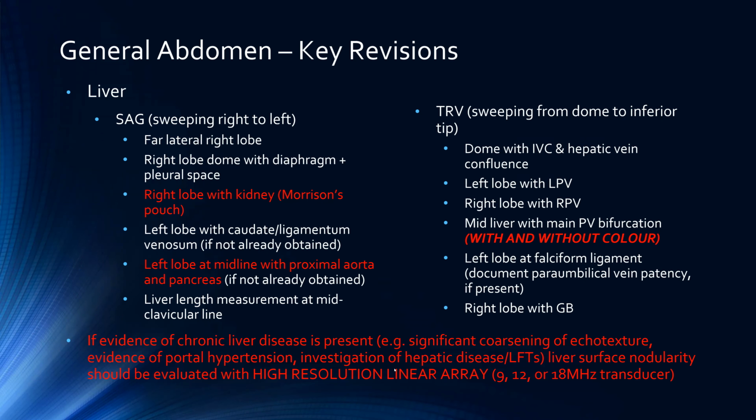Yeah, so, or if the examination is being performed for the investigation of hepatic disease or abnormal LFTs, we really should be investigating the hepatic contour nodularity with high resolution linear imaging. Often this nodularity can be appreciated on curvilinear, but I think it's good practice, if it's not too much difficulty, to also obtain a linear image showing higher resolution of that surface to investigate for nodularity.